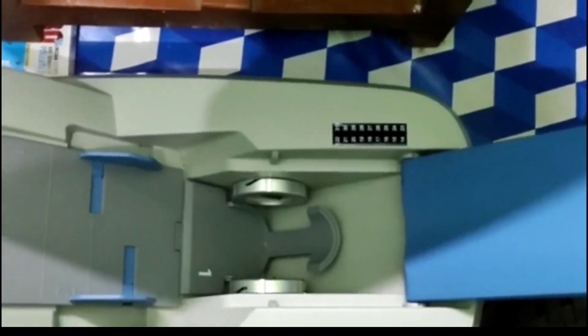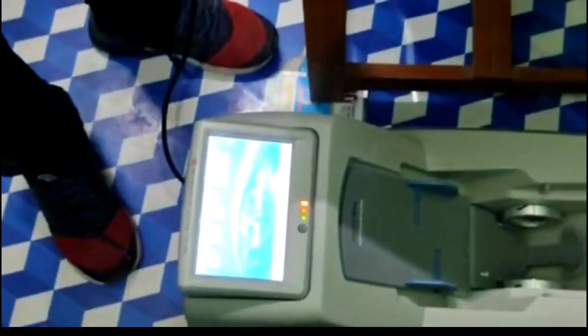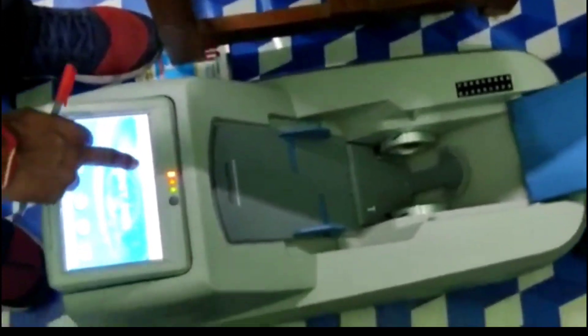Typically we start by speeding up. We have to put the device to calibration and adjust accordingly. The patient registration is then completed.